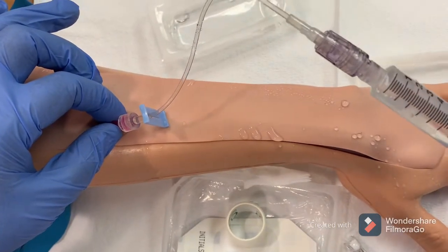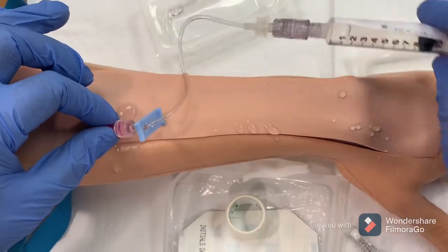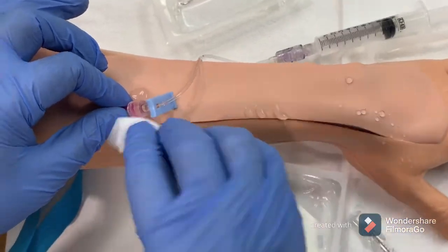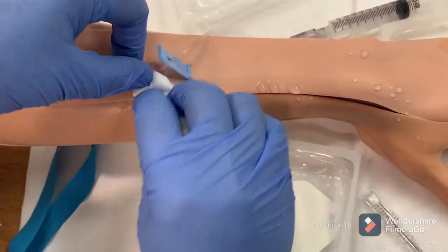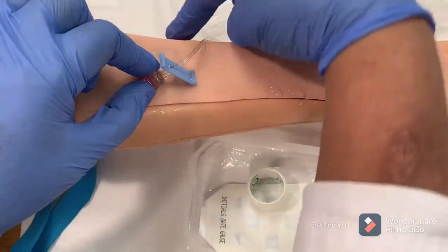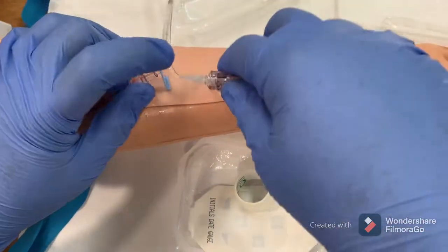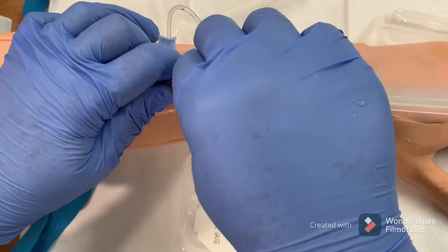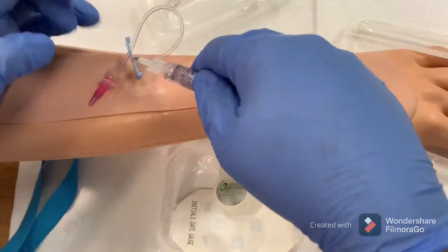Attach the extension tubing without losing the catheter. Check the blood flow by aspirating the extension tubing, then flush and wipe all the blood around the site. Clean the site very thoroughly before you apply the dressing. Remove the flush.